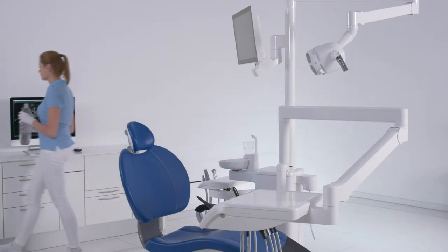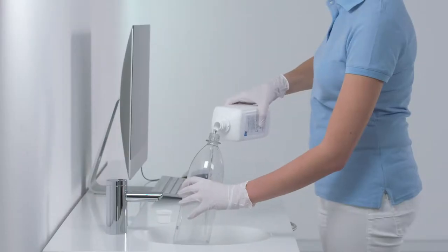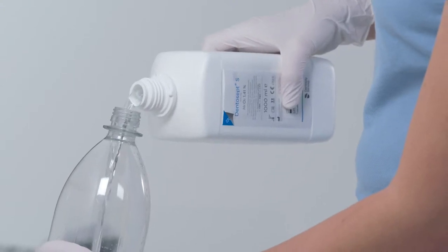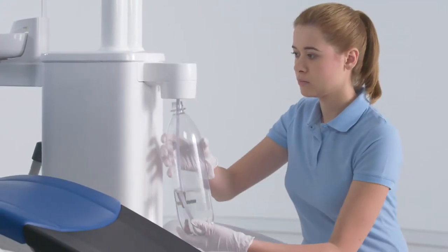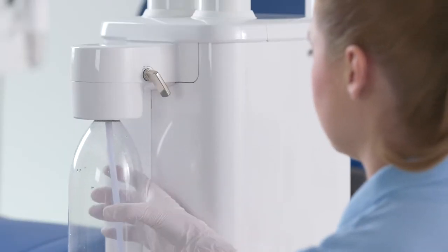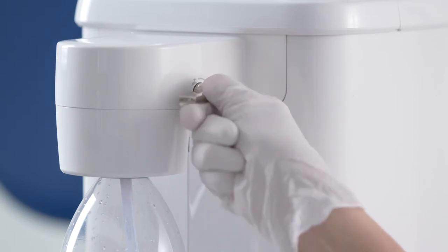Drain the treatment water from the fresh water bottle and then fill it up with Dentosept S. If your treatment center is equipped with the option to change over to the public drinking water supply, it must be switched to operation with the self-contained water supply through the fresh water bottle.